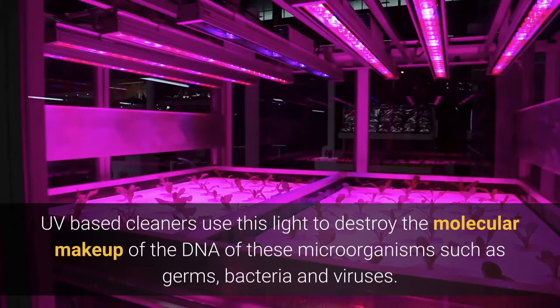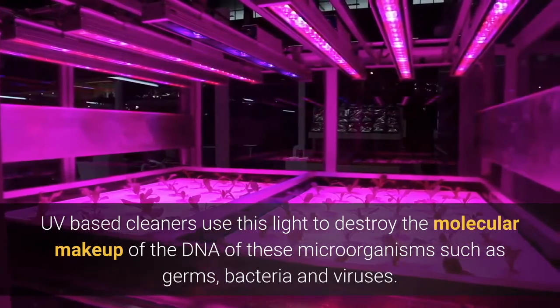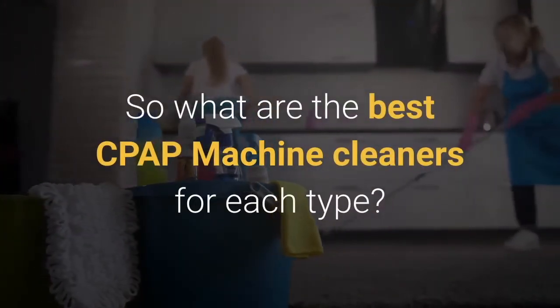UV-based cleaners use ultraviolet light to destroy the molecular makeup of the DNA of microorganisms such as germs, bacteria, and viruses. So what are the best CPAP machine cleaners for each type?